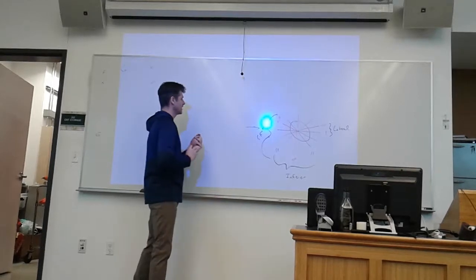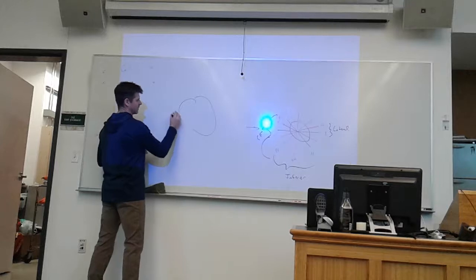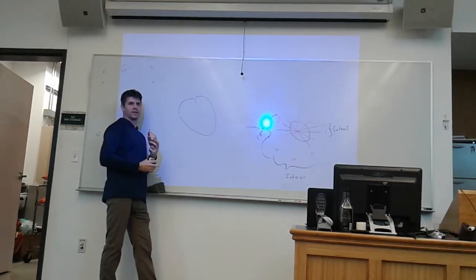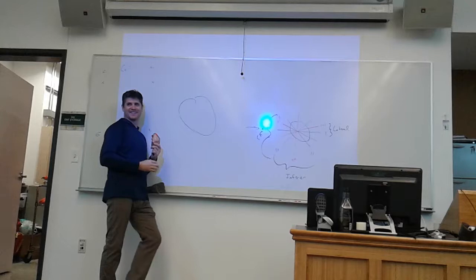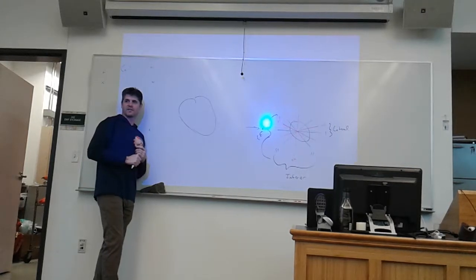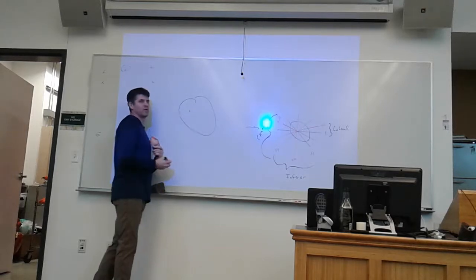So on the precordial leads, where are they located? This is the heart. Right side to septum. One is right, two is middle. Good. One is on the right, V1, V2, V3, V4, V5, V6. Okay, so V1 and V2. V1 is septum.